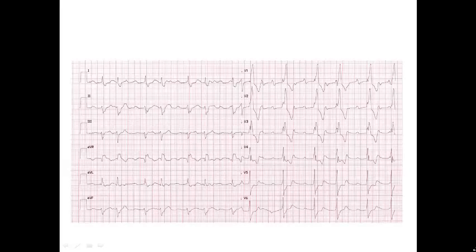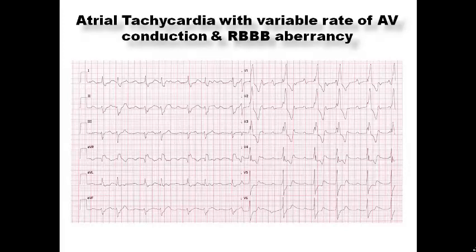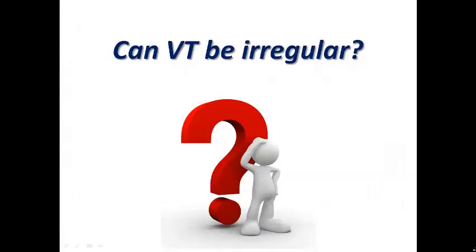Let's see this example. We have an irregular wide complex tachycardia — the heart rate may not be very rapid here — but we can see P-waves present between the complexes: sometimes three P-waves between complexes, sometimes two. This patient has atrial tachycardia with variable AV conduction and right bundle branch block appearance, presenting as irregular wide complex tachycardia. This is not a very common example in practice, but remember that atrial tachycardia and atrial flutter can also present with irregular wide complex tachycardia.